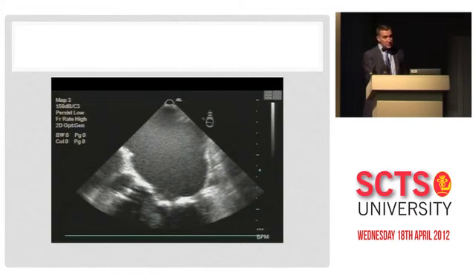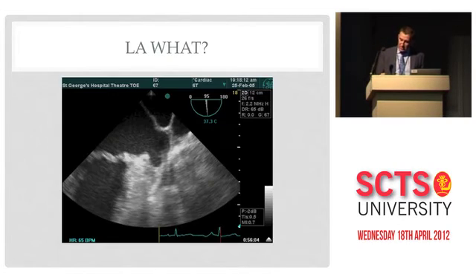And in fact, you see with these patients with very big left atria, sort of infolding and invagination of that left atrium as it comes off bypass unfilled. And actually, when we filled the patient up, the perfusionist did their bit, and I squeezed a bit of colloid in, the left atrium expanded, and that mass disappeared as the atrium expanded, and those sort of infoldings, which gave the echo appearance of a mass, disappeared.